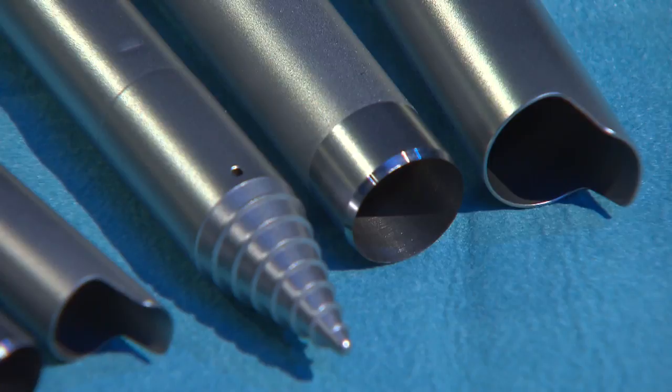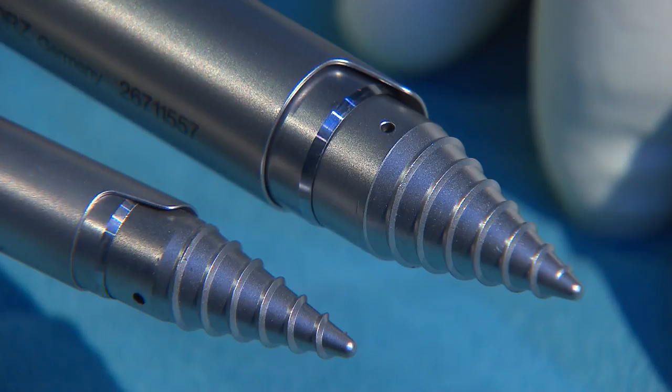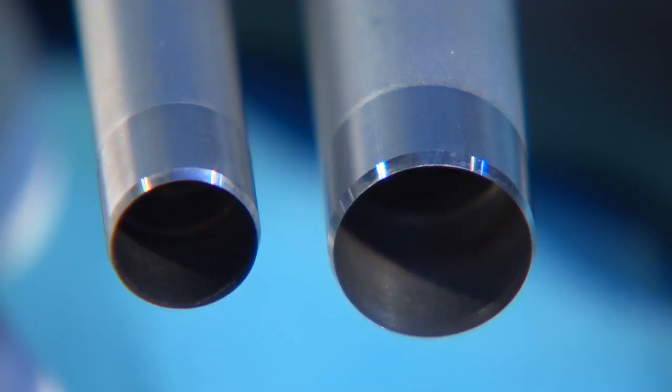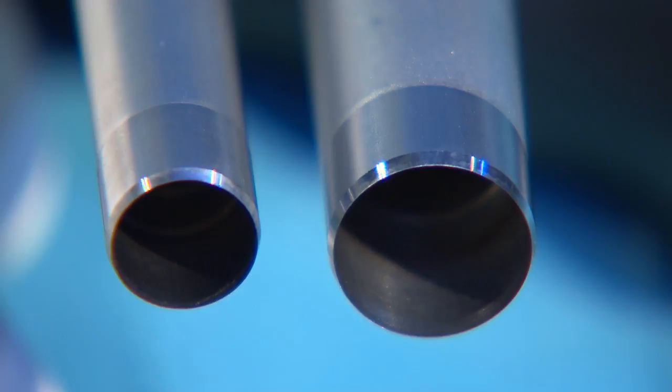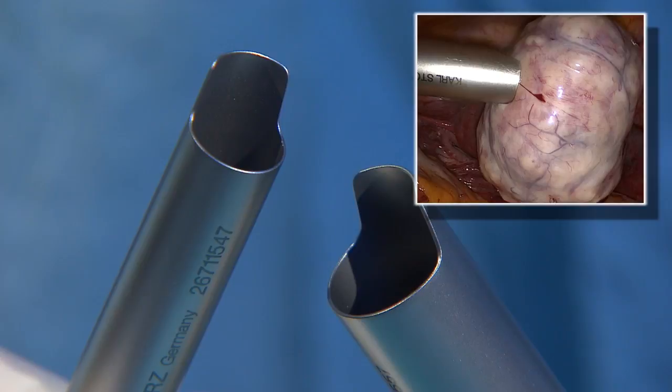The special thread obturators and knife guard allow atraumatic and safe insertion of the morcellator. The projection on the protective tube fixates the tissue and facilitates morcellation. Alternatively, a straight protective tube is also available for morcellation of large volumes.